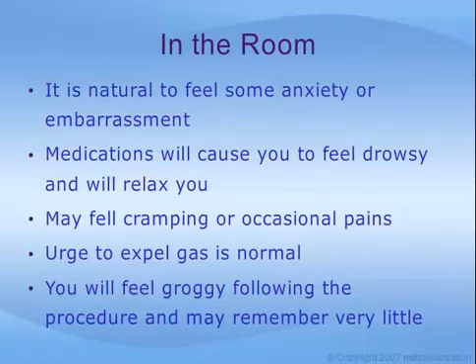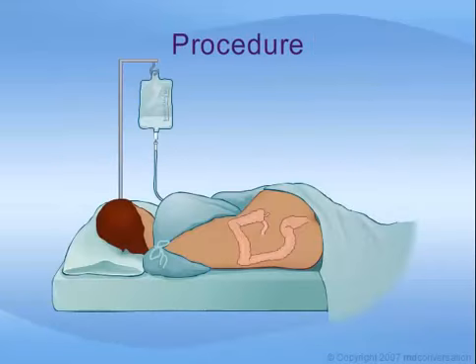You will feel groggy after the test until the medication wears off, usually in a few hours. Many people report they remember very little of the procedure because of the sedative given before and during the procedure. For the colonoscopy procedure, you'll be asked to lie on your left side on the examining table with your knees drawn up to your abdomen.